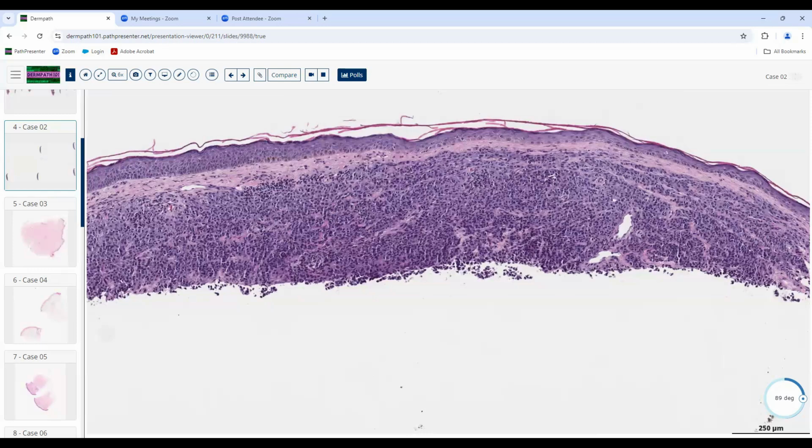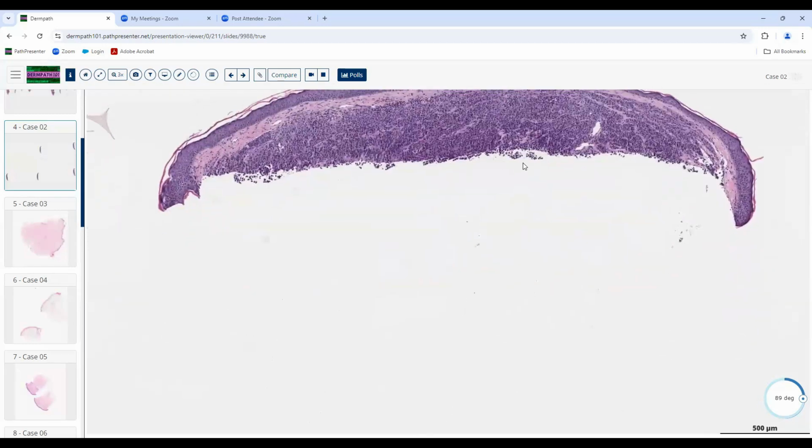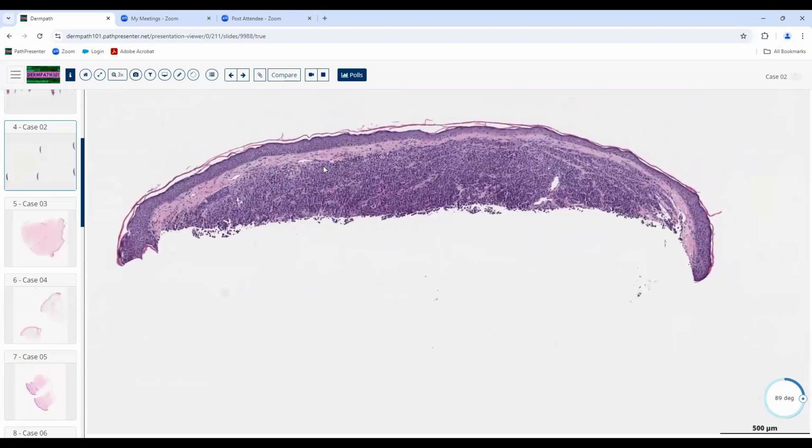when they have that pattern, surprisingly. But whenever you see something like this, where you get a melanocytic lesion, so we know now that it is melanocytic, that's almost as broad as it is deep, and it doesn't involve the epidermis, that's a very good clue that you're dealing with a metastatic malignant melanoma. So that's a situation where the pattern loses. It looks small, it looks symmetrical, it looks well circumscribed, but it's still cancer.